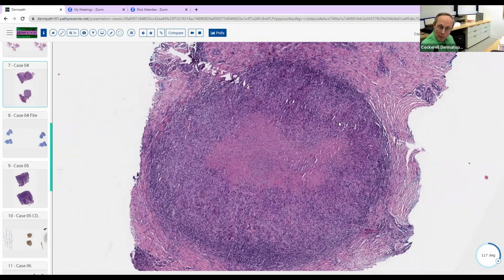Okay, so let's talk about those two, for example. If you're going to place a bet with your attending physician, if he sees this slide here, what are you going to bet on? AFB or fungus here, and why? I would say AFB. Okay, why? Just because of the caseating necrosis, I think, with cutaneous. That's number one. Yes, you're right. That's far more common in atypical mycobacterial infections.